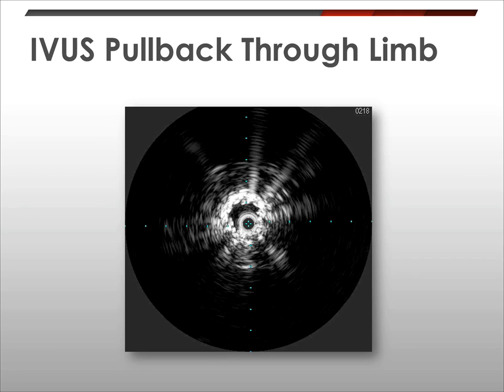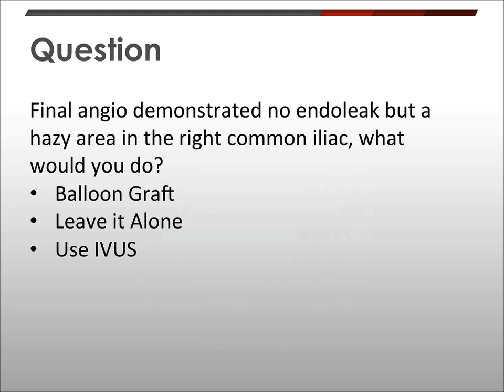If the stenosis takes place in an anterior to posterior geometry, that could only be identified if you move the image intensifier to 90 degrees. Once I've done my final run, again using 20 cc's for 2 seconds, I identify any abnormalities in the graft itself, any endoleaks, make sure there's good renal artery flow, and good internal and external iliac artery flow.